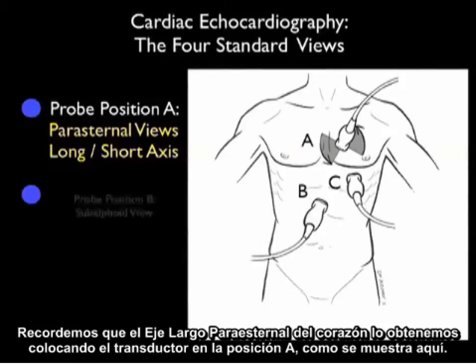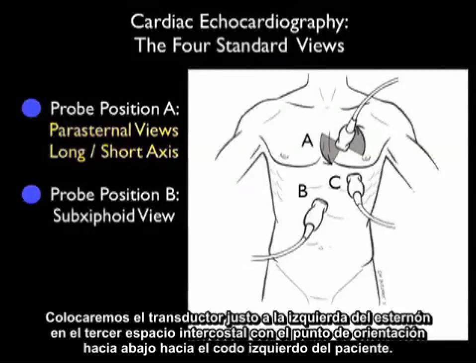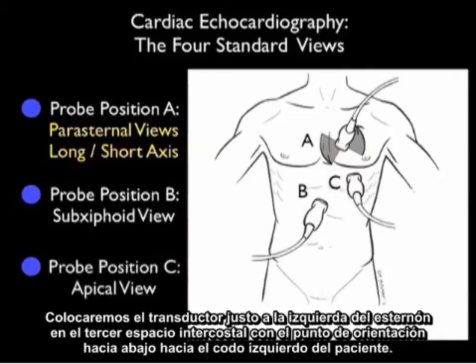Recall that the parasternal long axis view of the heart is obtained by placing the probe into position A as shown here. That will configure the probe just left of the sternum at about intercostal space 3, with a marker dot down towards the patient's left elbow.